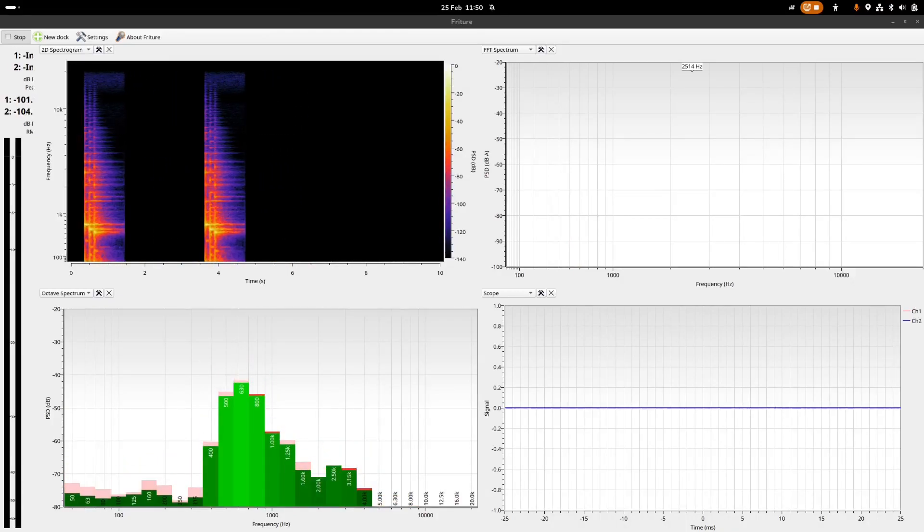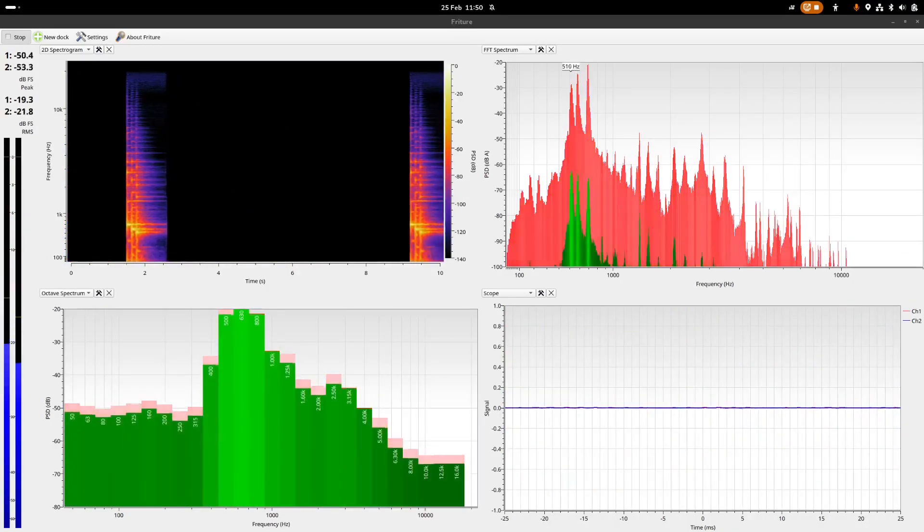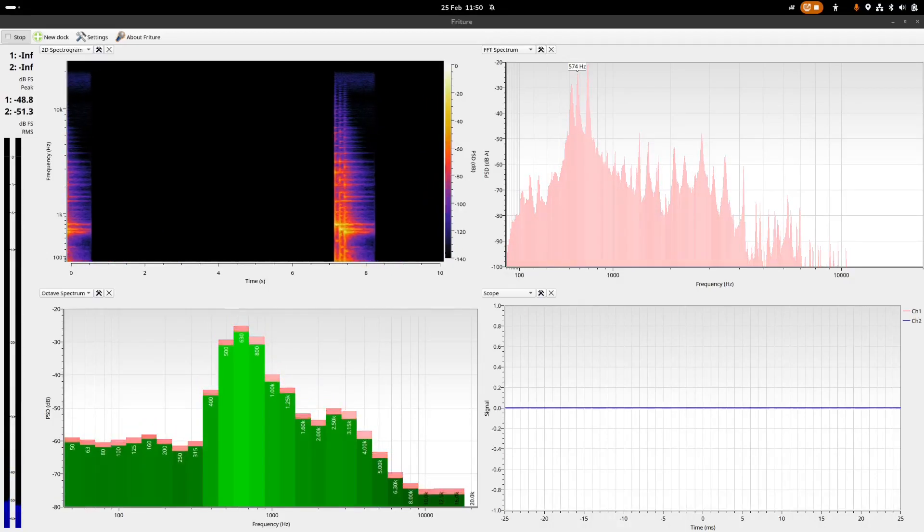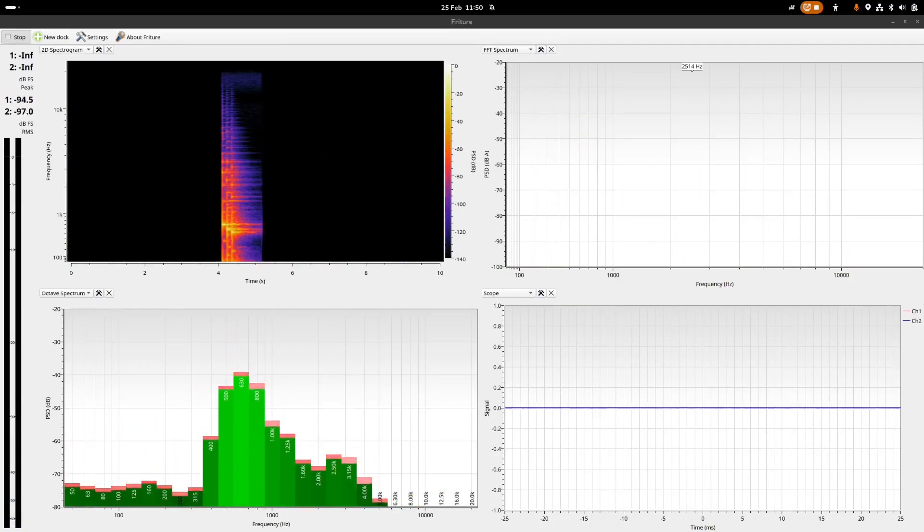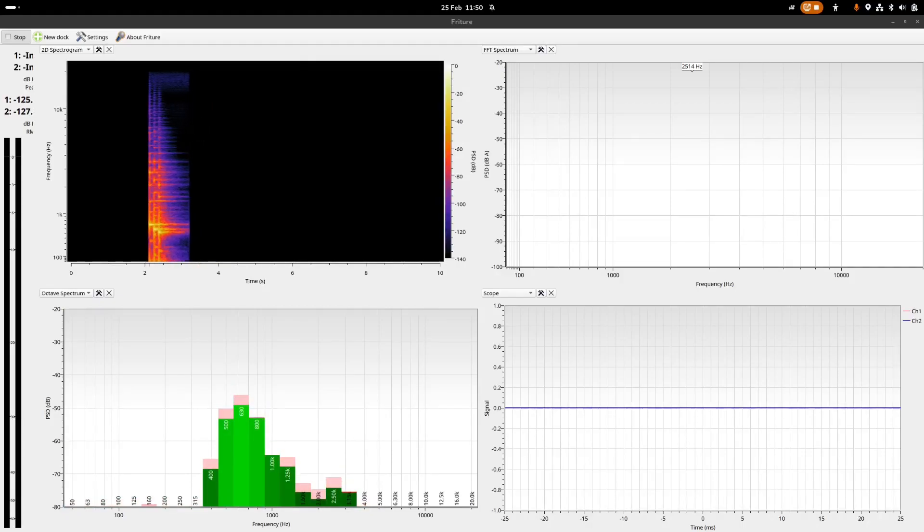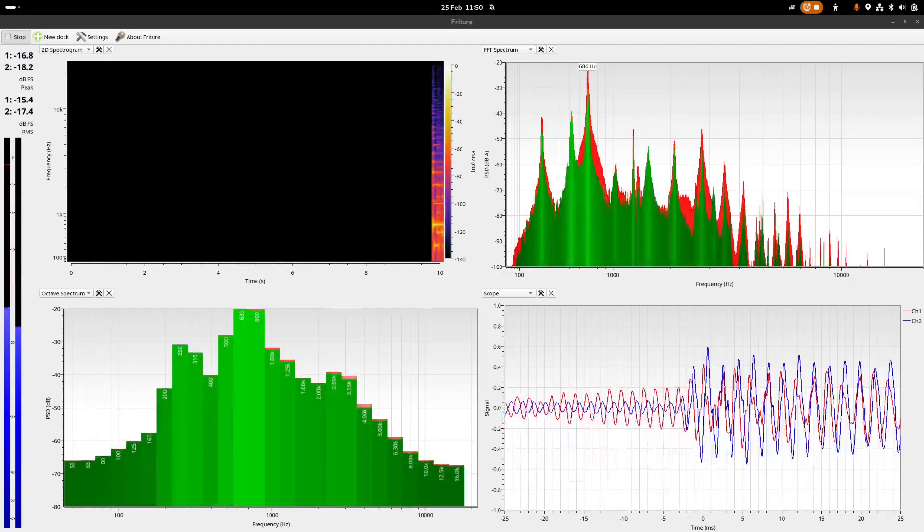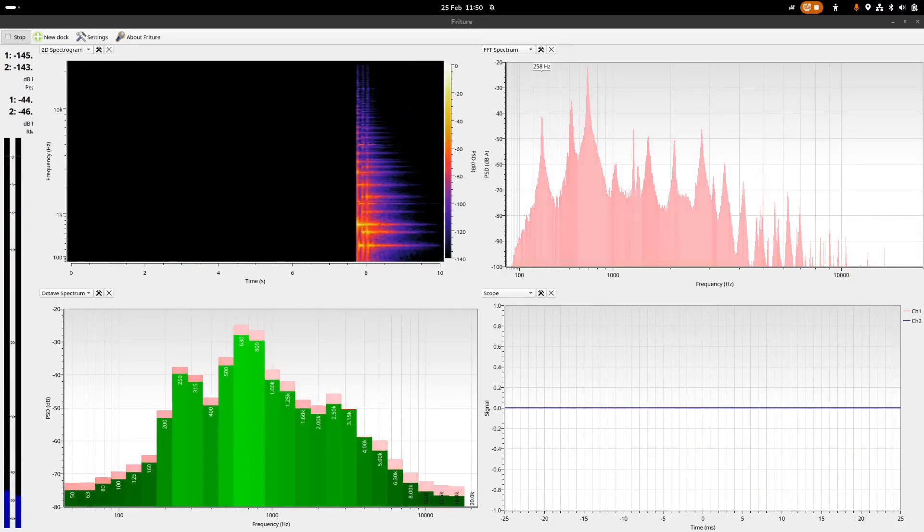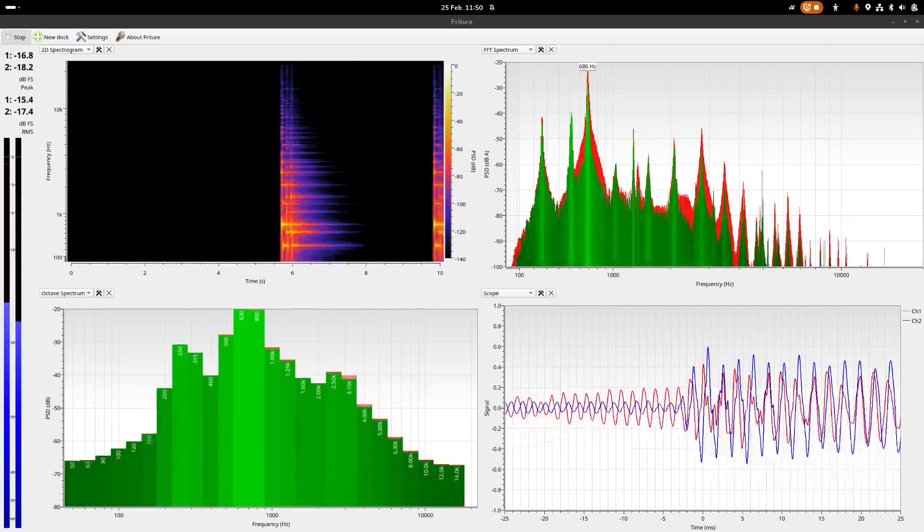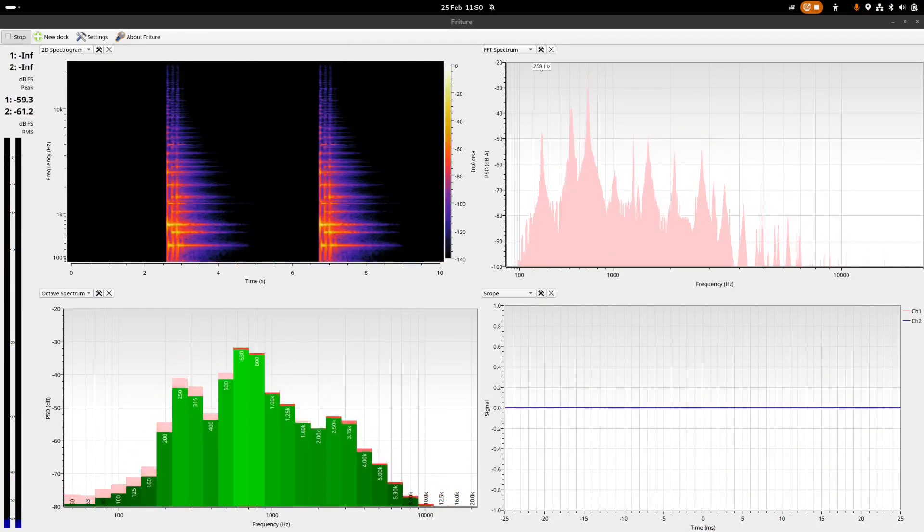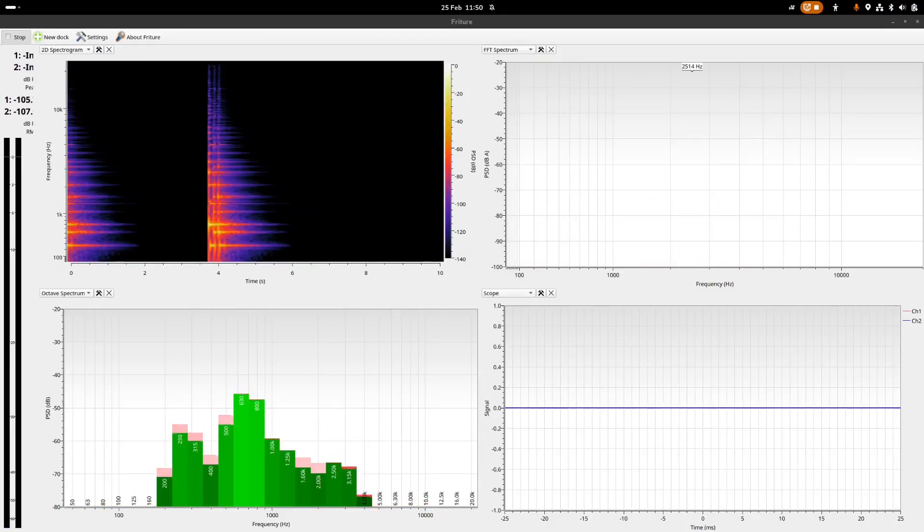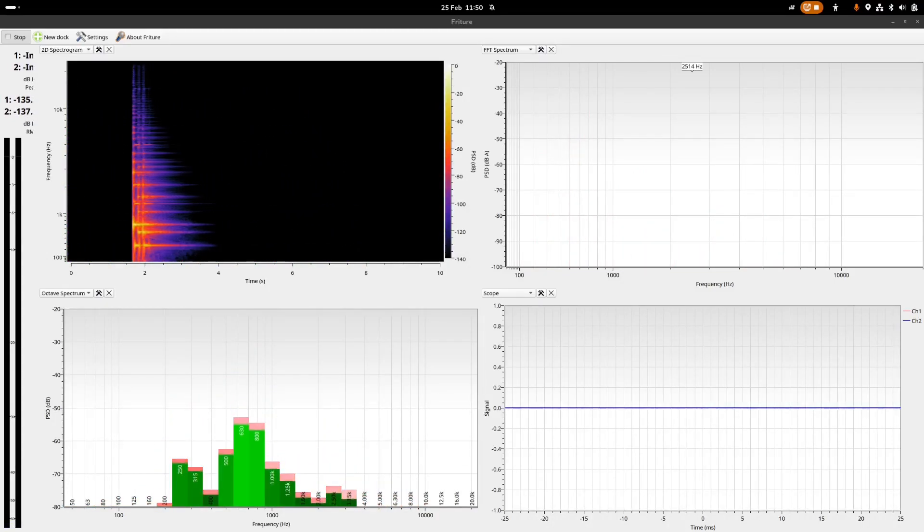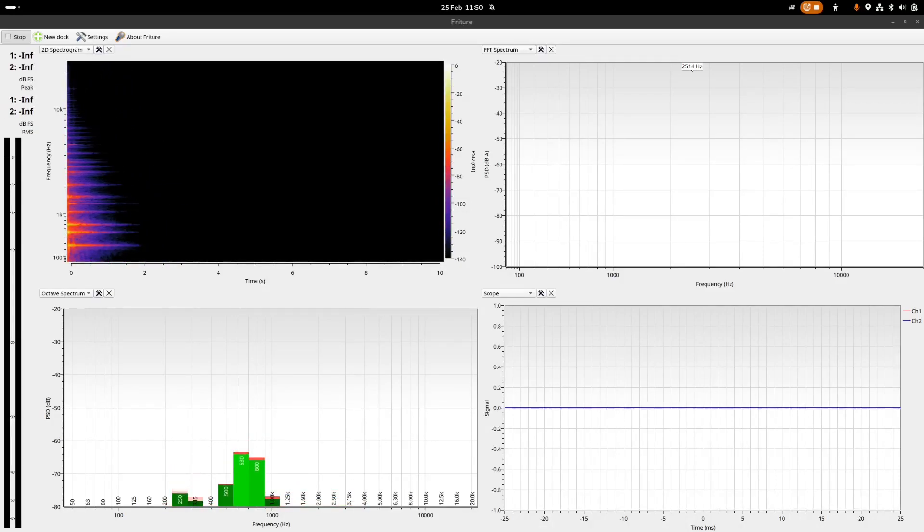On top of that they also have an urgent low which sounds like this. Now to me it sounds fairly similar to the previous one.